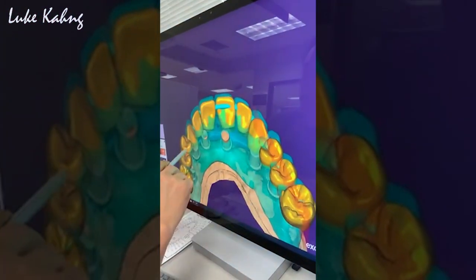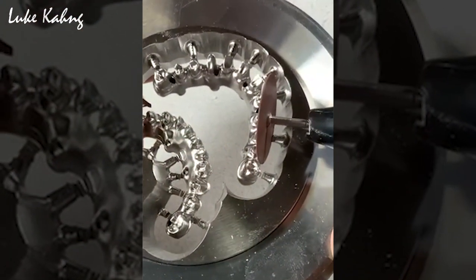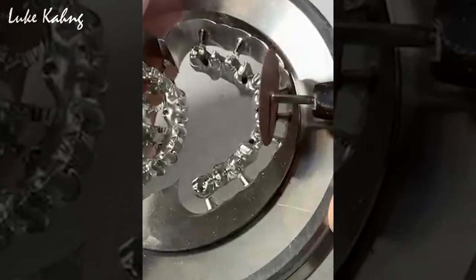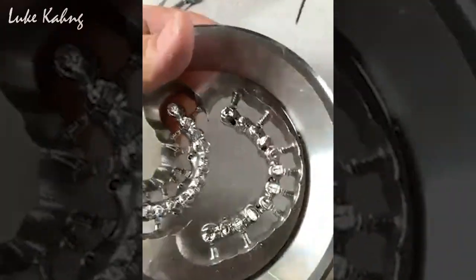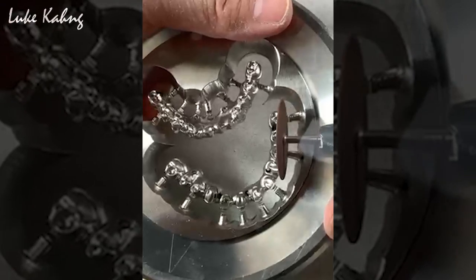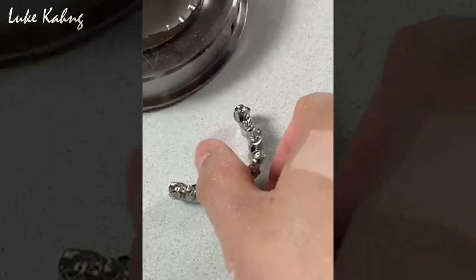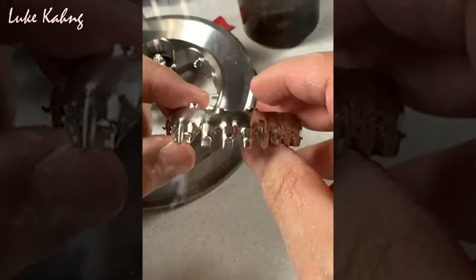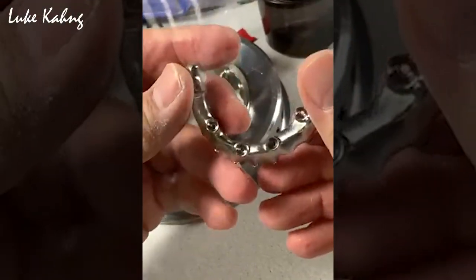So we're going to come up with another one. Cool stuff, let's try. I'm going to remove the sprue.